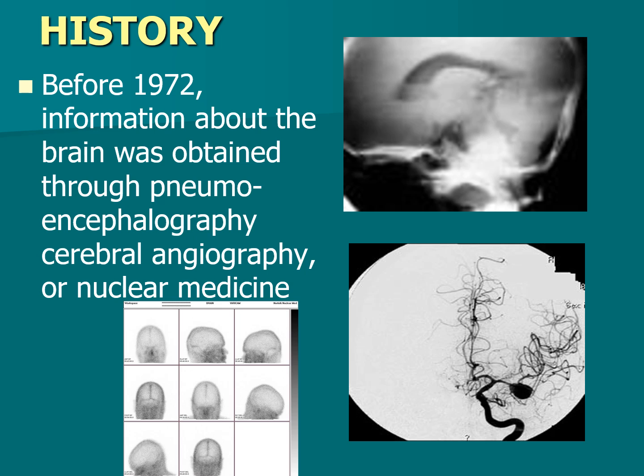If we just look at a little bit of history in our original scanning, CT is phenomenal. It has brought us into a modern age, and the modern CT is a total different animal than the CT that I did in the late 80s, early 90s, because that was before helical scanning or volumetric or fast scanning even existed. So a little bit of history.